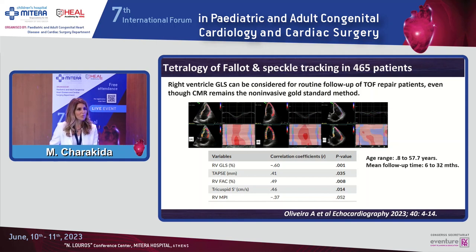And most of the time, if we want to assess right ventricular function, we rely on MRI to do so. However, MRI, while great, remains expensive. It's not at the bedside. So we need to find another echocardiographic method that can provide us information and help us track these patients.